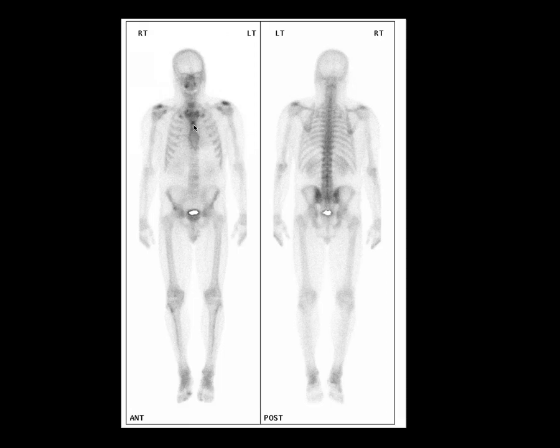This area of activity is a normal finding at the angle of Louis, or manubriosternal articulation — a small central round area of discrete activity. It's important to note this because we don't want to confuse it with fractures or breast cancer metastases. The sternum is very frequently involved in local spread from adjacent breast cancers.